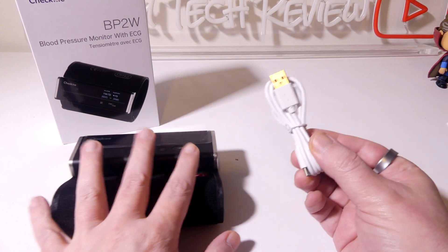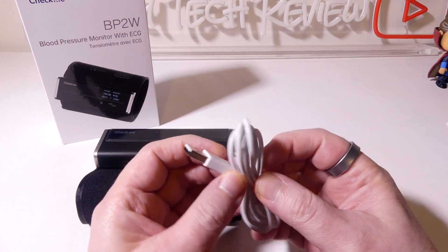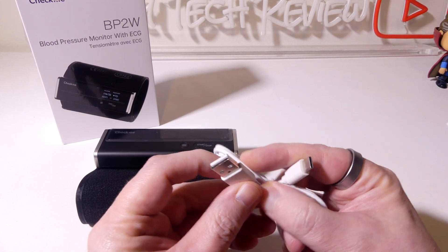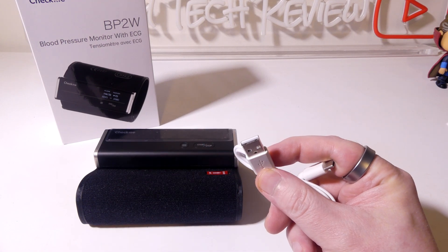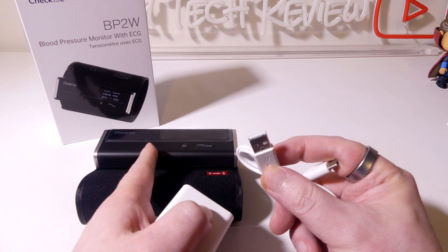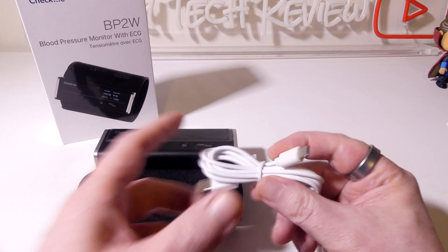To recharge the internal battery, you have a standard USB Type-A to USB Type-C connection. You can plug this into any PC or laptop's USB port, or if you have an AC to USB adapter from another device, that will work just fine to recharge the rechargeable battery inside the BP2W.